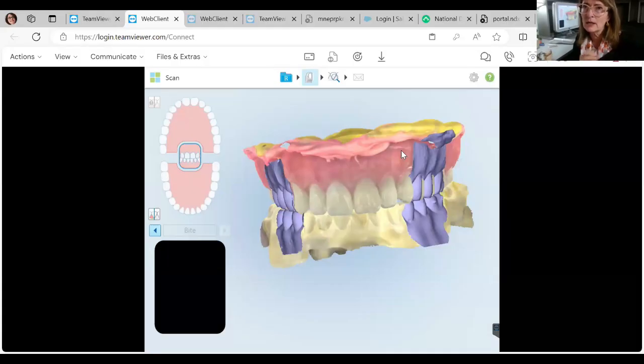The only time I use a transfer marking stick, a Dr. Thompson stick, is when working only on the maxillary arch, intraorally on the fully edentulous patient. That usually is a patient that's worn a denture for 30 years and it's super smooth. Like there's no rugae definition, it's really, really smooth. So I'll put some markings there just for my eyes to follow a particular path to help stitch the data together. Great question.